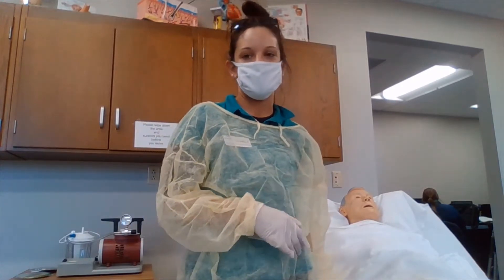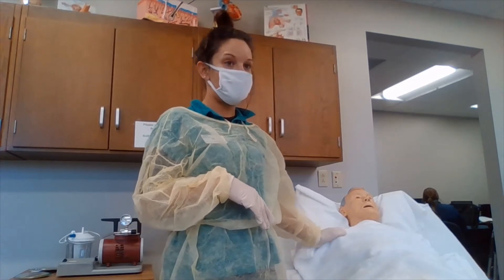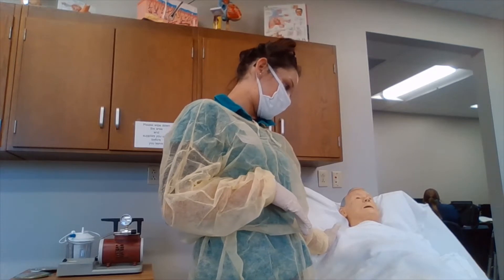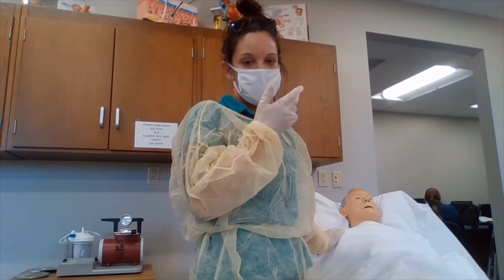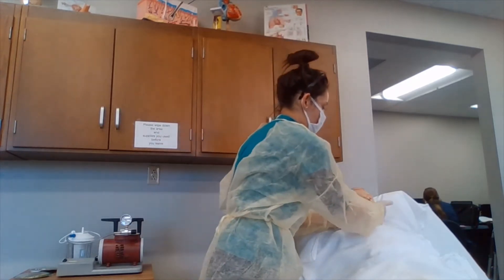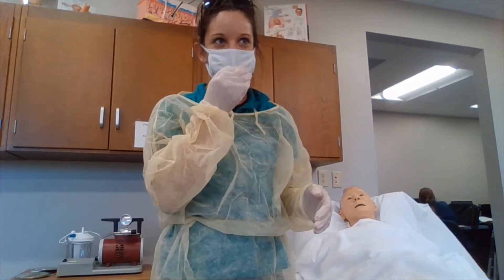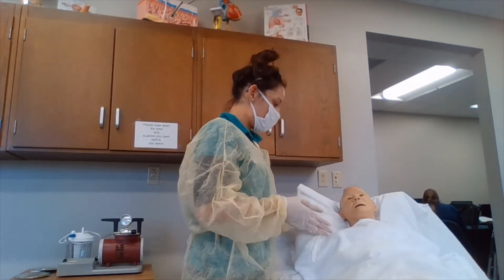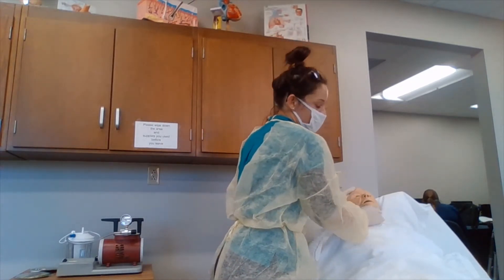For performing upper airway suctioning, for oropharyngeal suctioning, we are going to have our patient in semi-Fowler's or high-Fowler's position, with their head towards the nurse. For nasopharyngeal suctioning, the patient is going to be in the same high-Fowler's position, and they are going to have the neck hyperextended.